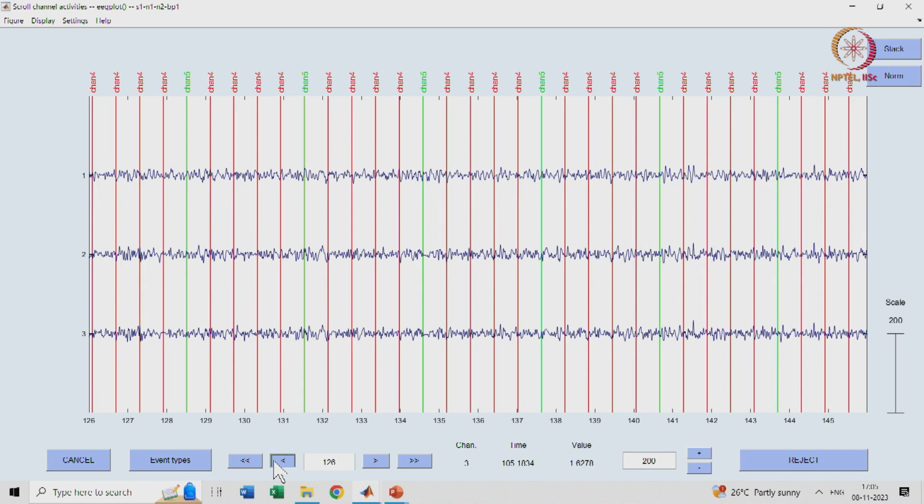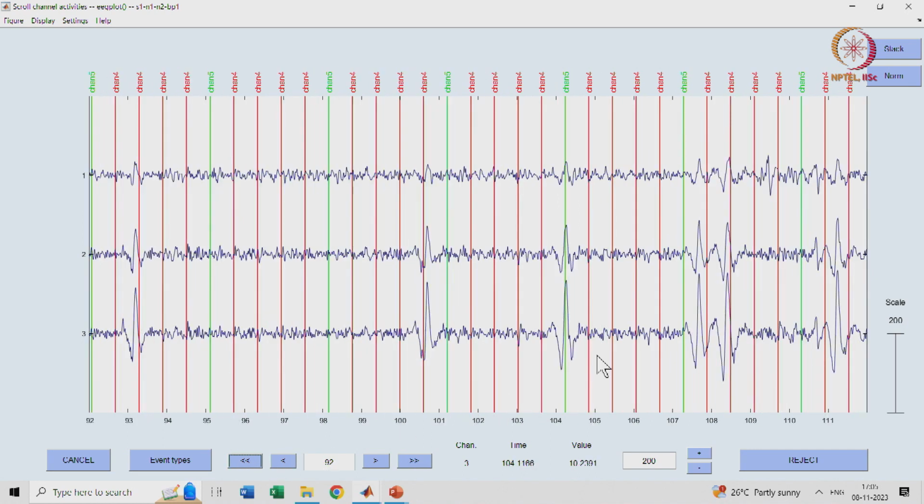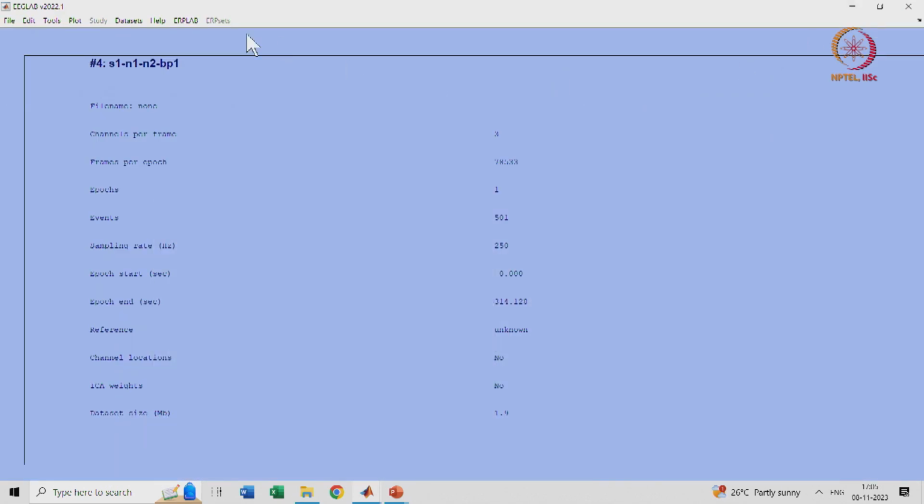As I mentioned, we can see that this is not due to the neural response, but due to an eye blink. So we have to remove this, right? There are several steps which we need to perform in order to remove the unwanted non-neural things. One of them was filtering, one of them is artifact rejection, which I'll show. Filtering is allowing selective frequencies, whereas artifact rejection is allowing certain selected magnitudes.